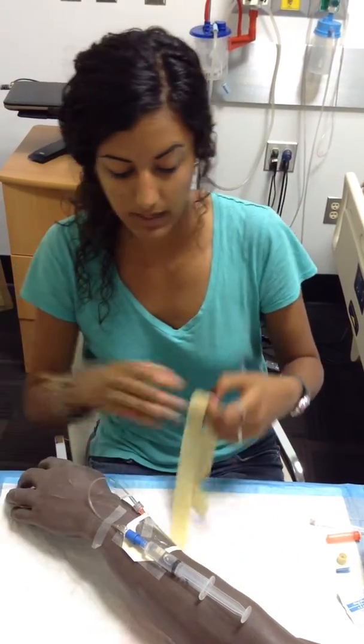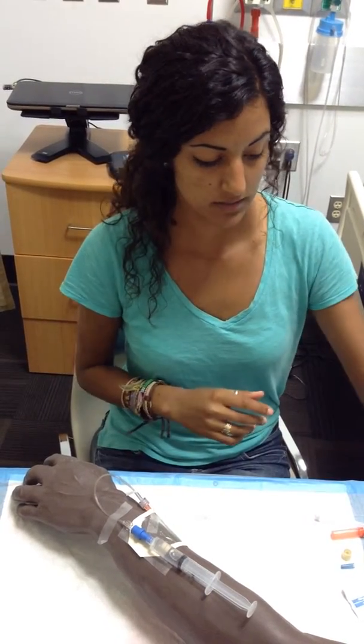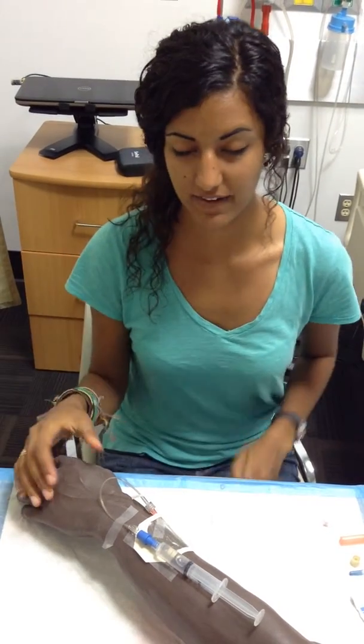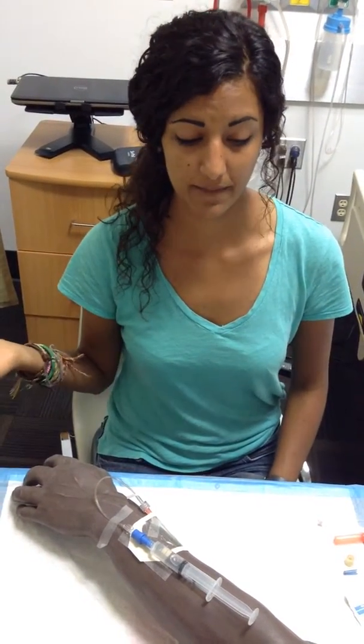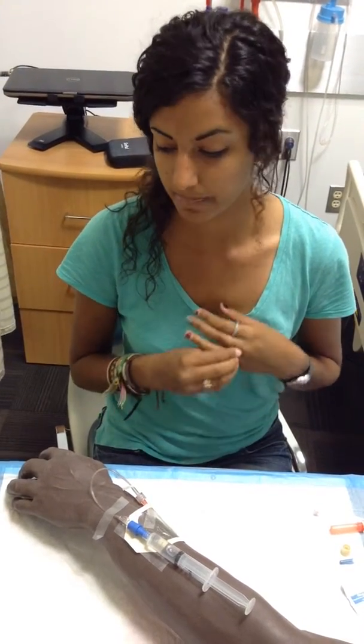And then I will receive the doctor's orders to discontinue. So I'll come into the room, again wash my hands, identify the client, introduce myself, answer any questions that they might have, and just explain what I'll be doing.